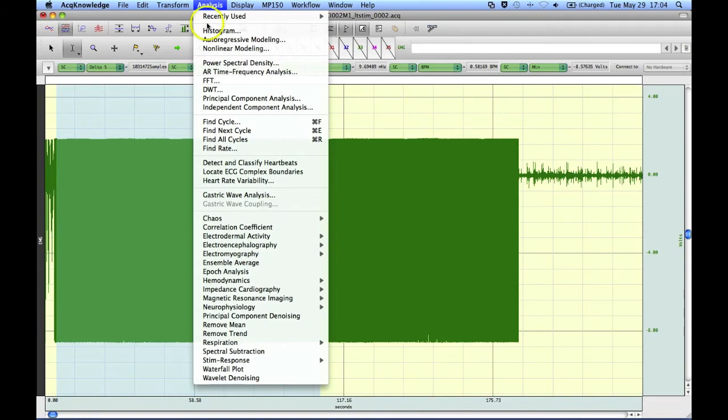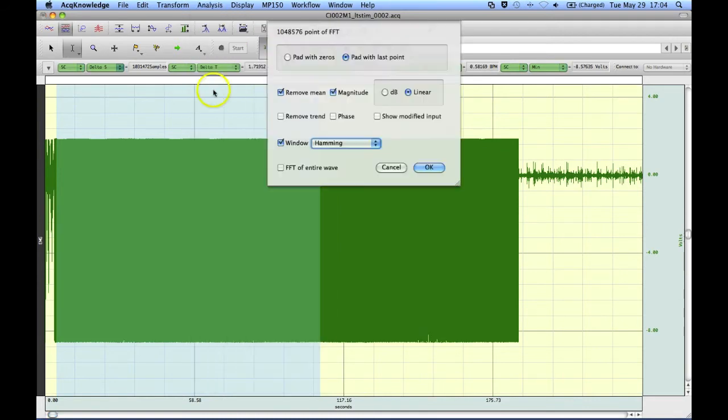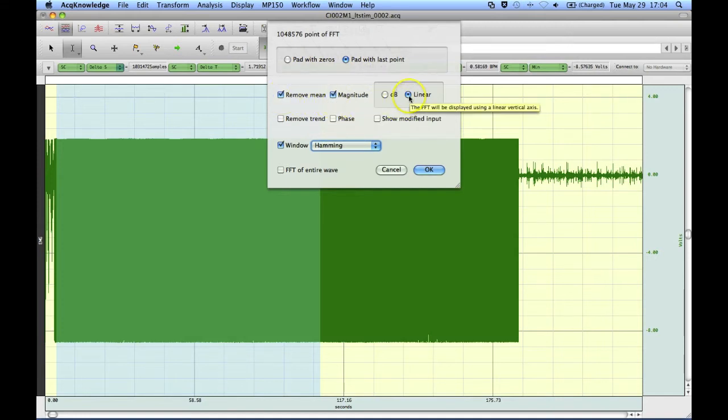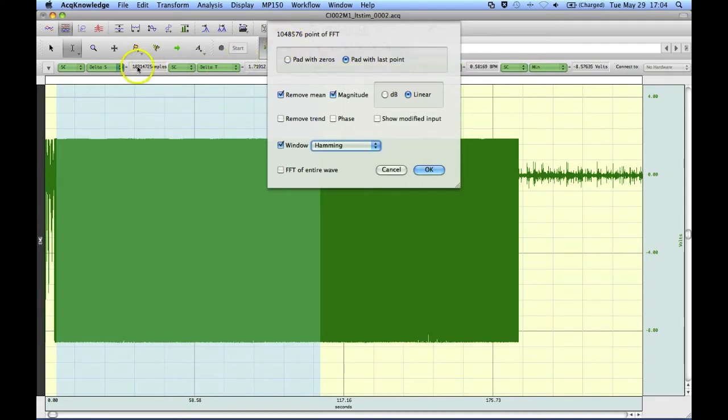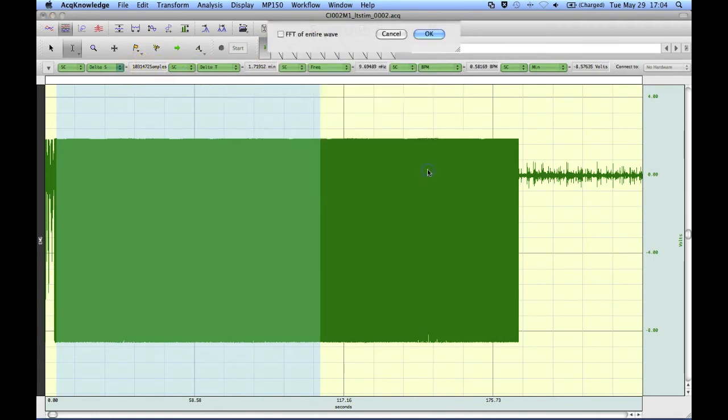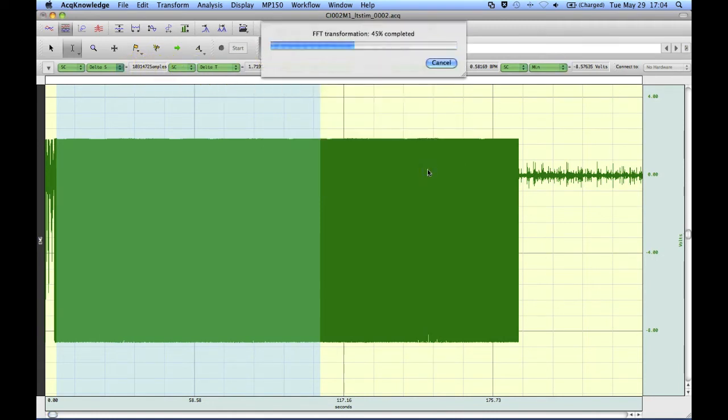If I go to the analysis menu and select FFT, I'm going to pad with the last point, remove mean, magnitude and linear. This is going to pad a little bit but not too much. 1,048,576 and I've selected 1,031,472. So we'll give this a go and see what we get.